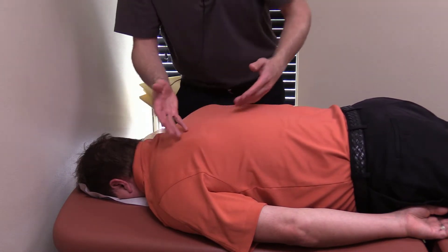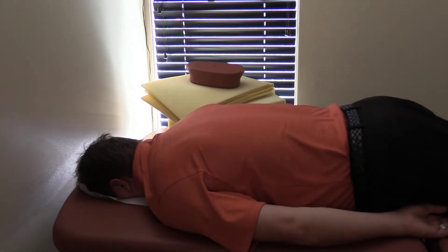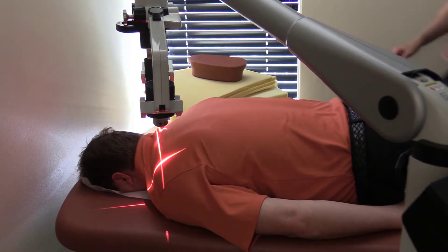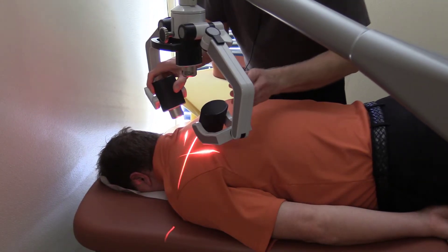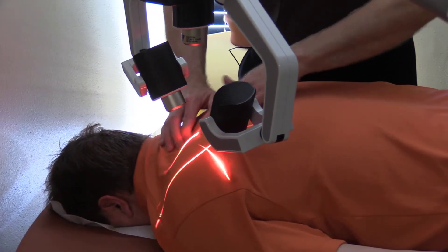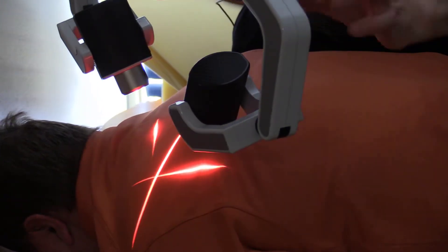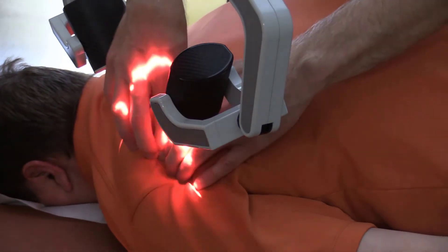This is a great position — just put the lasers and I'll show the setup real quick. It's about evaluating and then getting them in the right spots, working on something very useful. Any knot, any tight muscles, is always a great spot to work, especially if that's where their pain is. I can work up here in the rhomboids and traps, and get out here in the infraspinatus, or go for spots anywhere down through here.